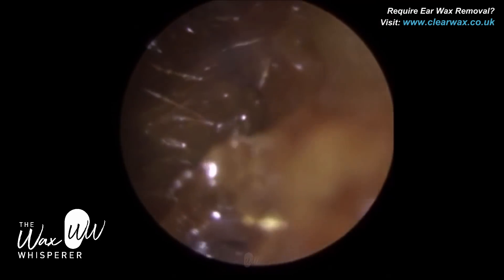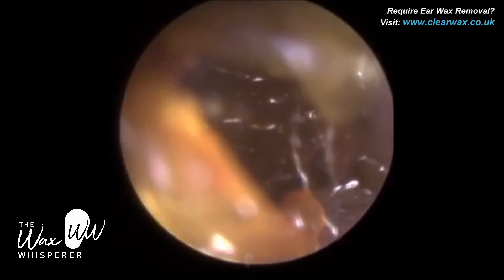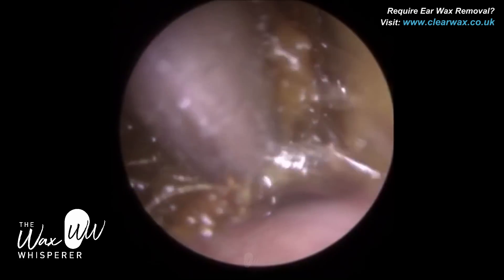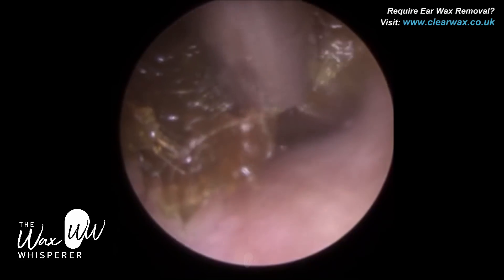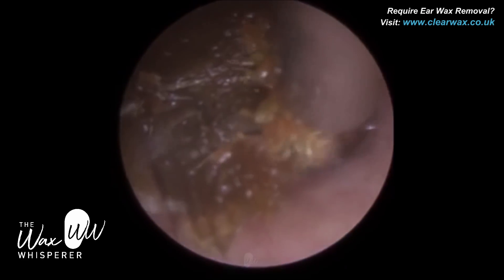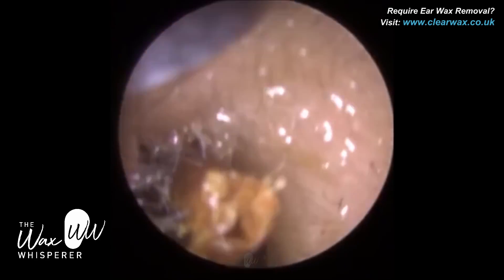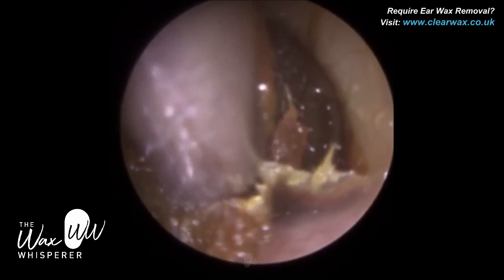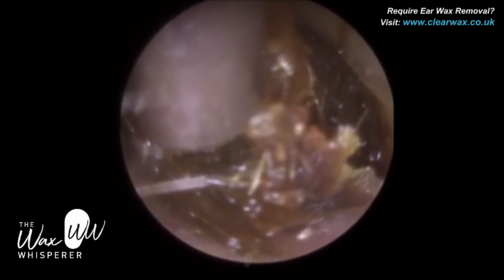We were quite fortunate. I put some more drops in again at this stage. You can see that's a strand of keratin being pulled through the plug of wax — you can see the oils are quite glossy from the drops we just put in. This plug of wax extends right to the eardrum. We're past the second bend now — there are two bends: the first bend is about half a centimetre into the ear canal, the second is about a centimetre in where cartilage and bone meet. Then about half a centimetre from the eardrum, the ear canal narrows at the isthmus and protrudes back out. This plug of wax has gone beyond that narrowing, so it's truly plugged.